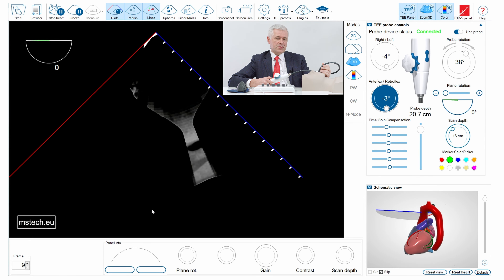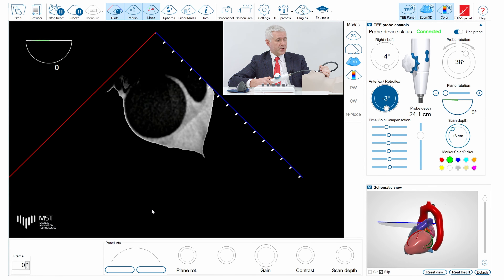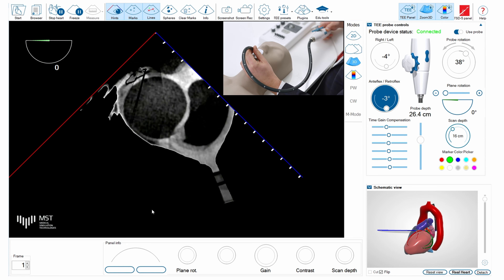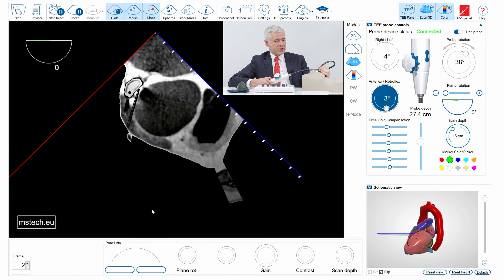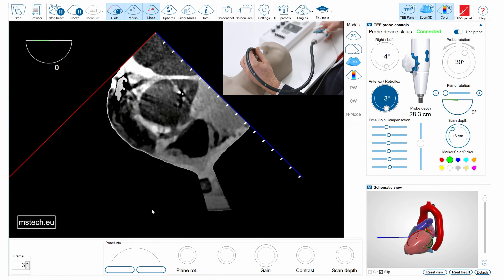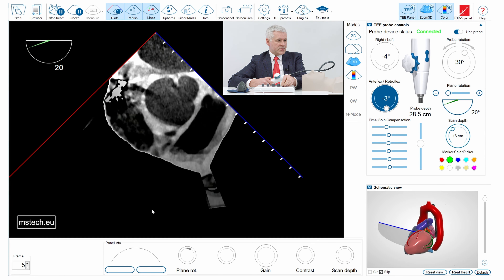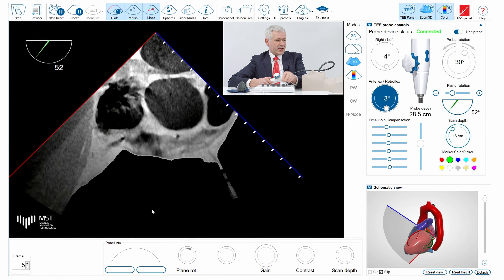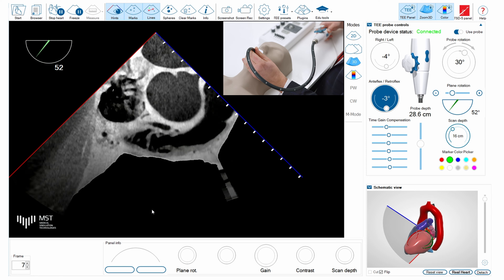The case has been loaded and I'm approaching the ascending aorta with the probe pushed into the esophagus, going down slowly. You can see the aortic root now with some calcium here. Let's have a look at the 30-degree view now to see what kind of valve we have here.